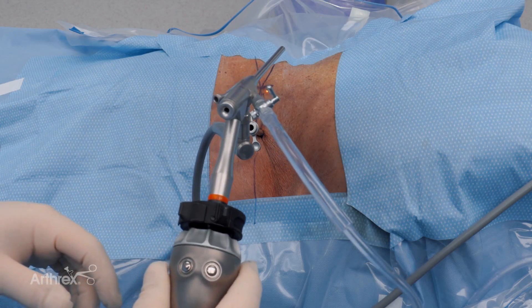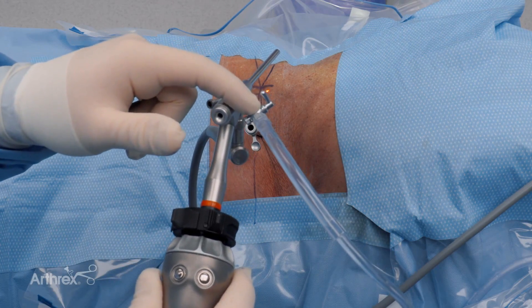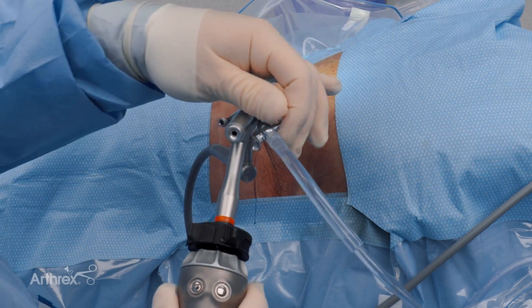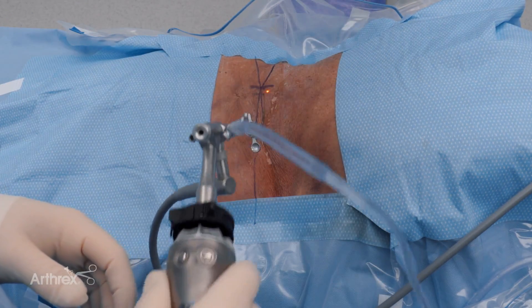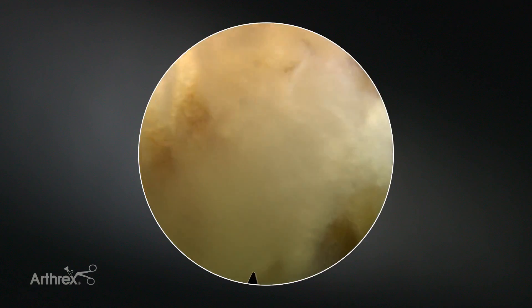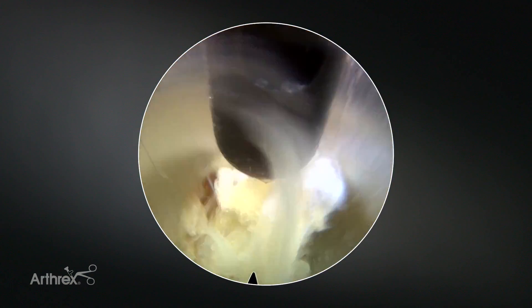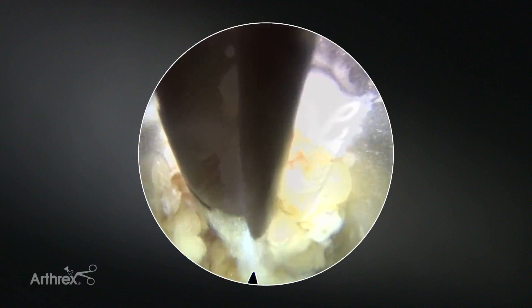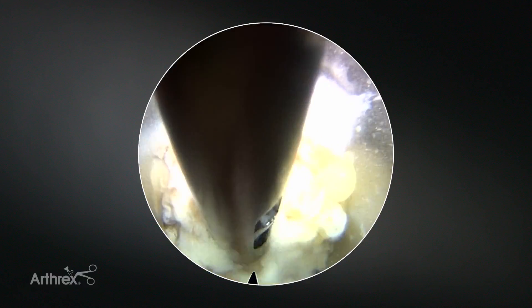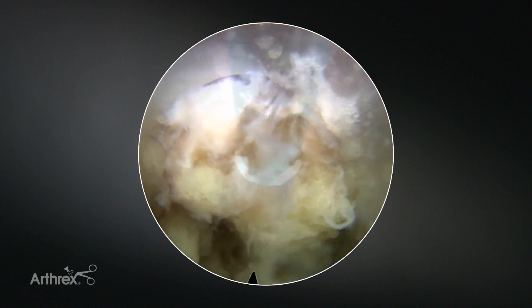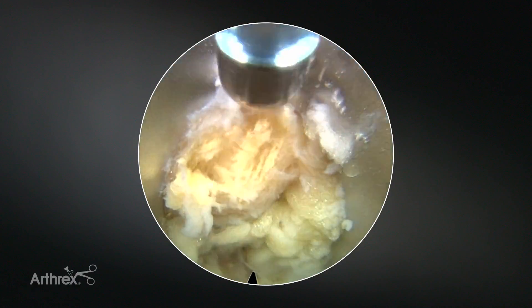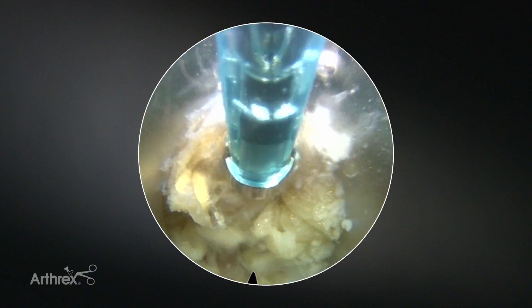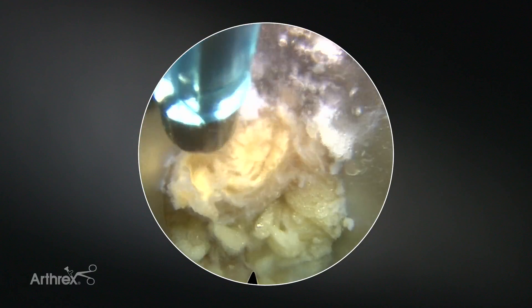Now we're going to introduce the endoscope. I like to place the water flow on the right side because I like to hold the scope with my left hand. We're going to turn the water on and introduce the scope into the cannula. We've introduced the endoscope — I can feel bone dorsally. As I go dorsally, I can feel bone here — that's my superior articular process. This is some facet capsule and intertransverse ligament that we punctured through with the dilator set.